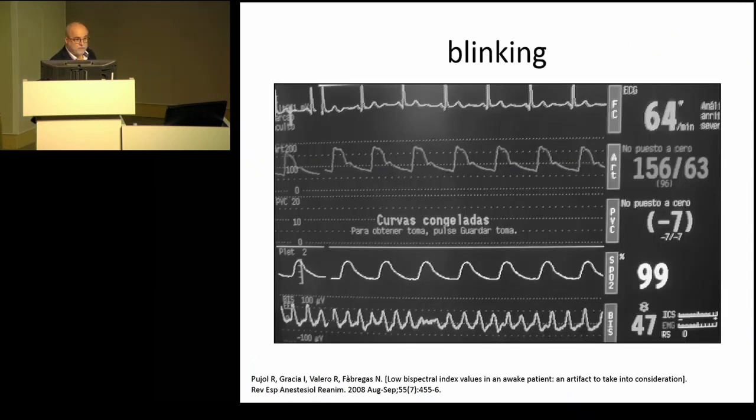For example, this is an example of our experience. That was a patient just entering the operating room. The patient was not even premedicated yet, and the patient was blinking.